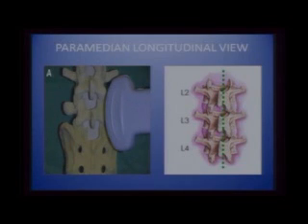If you come a little more laterally, you see a continuous line of bone. You have the facets of all these vertebrae interlocking together. So at this level, you will not have any ultrasound beam passing through. If you come a little more laterally, you have this transverse process, this transverse process. In between the two, you have a huge window, and this is where you will find your lumbar plexus.